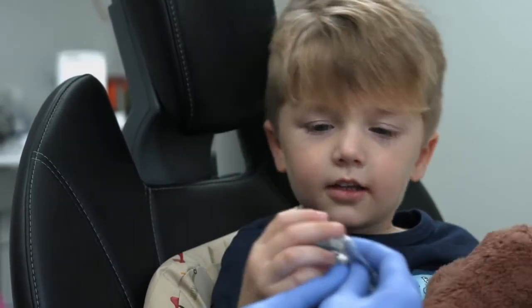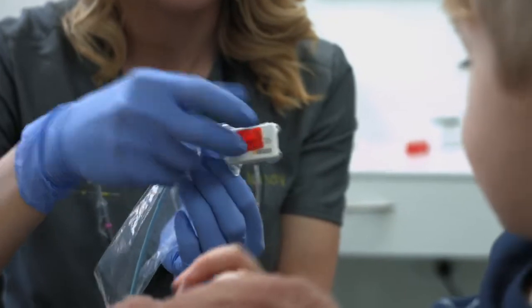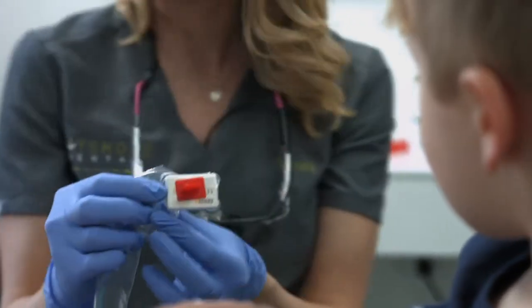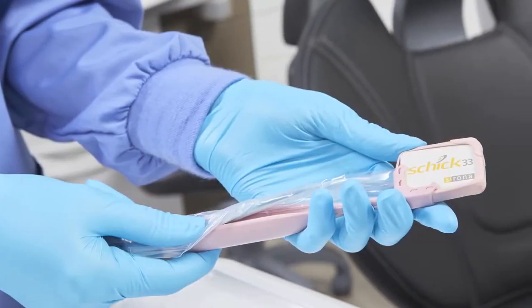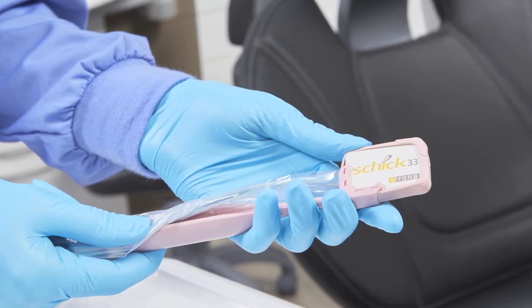Our size two sensor works great for occlusal shots on them as well. Our line of Aim Right adhesive positioning tabs allow for just the right placement no matter the child's size or anatomy. Our unique Comfort Wand sensor holder is designed to securely hold the sensor in place during radiographic exposure when there is little room in the patient's mouth.